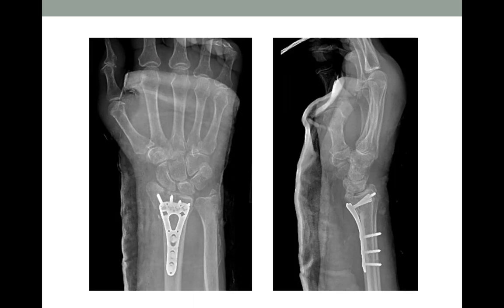One other question is on the radius. Why doesn't that radial styloid screw capture the radial styloid better? Why isn't it more into the styloid instead of dorsally? That's an excellent question. We struggled to get that styloid where it needs to be. It's a higher energy injury than just somebody falling. She went downstairs and that was pretty well smashed. It was hard to do that. We had to put a joystick in and try and wedge that into the right place. It's not great fixation into the radial styloid.